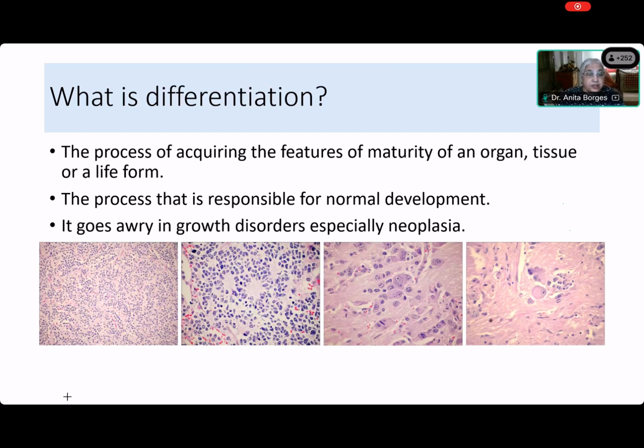This is undifferentiated. The first picture that you see over here, let me get hold of a pen of a different color now. This picture is an undifferentiated neuroblastoma. There is no differentiation at all. Because neuroblasts, when they are going from their undifferentiated component right up till they become ganglion cells, a ganglion cell is nothing but a neuron. So you have a neuroblast, which is going to become a neuron, and that neuron then gets associated with Schwann cells. So you have an undifferentiated neuroblastoma, a poorly differentiated neuroblastoma, then a differentiating neuroblastoma, and then a ganglioneuroblastoma. So this is a picture from left to right.